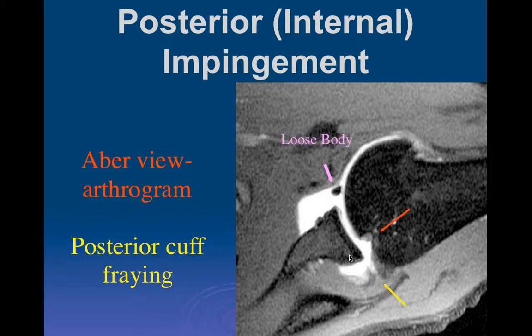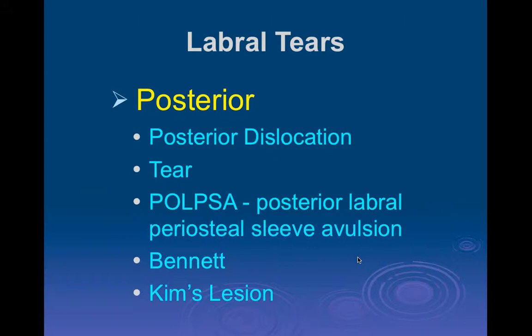And here, these erosions can become very large. Clearly this looks more like a sharply defined cyst, as you might expect if you have a chronic lesion that's carved out the trabecular bone and you're left with either fibrous tissue or fluid, just like a typical geode.